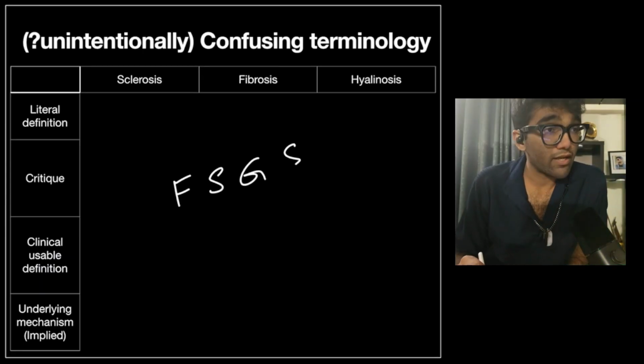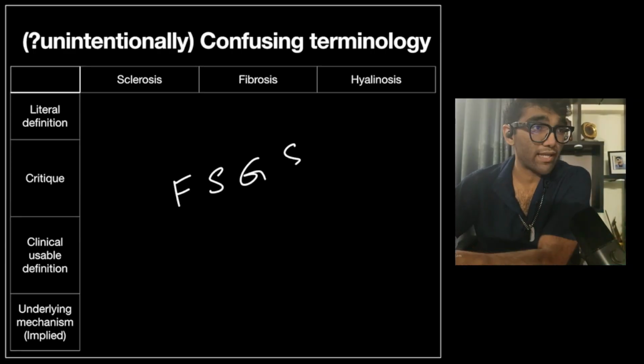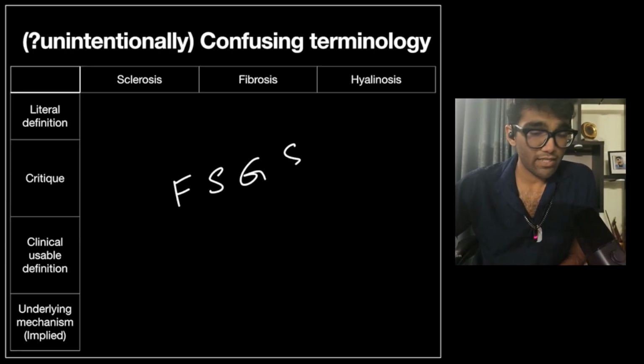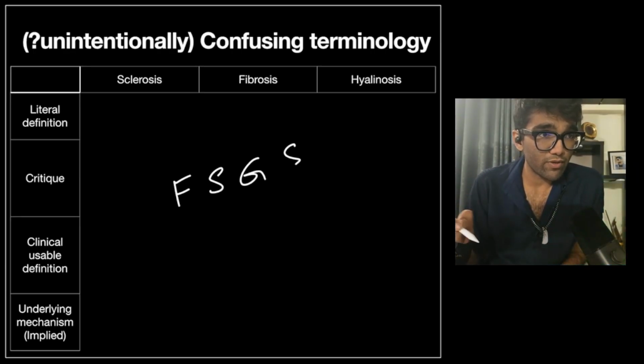Most textbooks and indeed most discussions on the topic tend to focus mostly on the FS part of it, that is the focal and segmental part of it. However, we actually need to go beyond that. But we'll see what focal and segmental mean first, and then we'll go ahead and discuss the others.